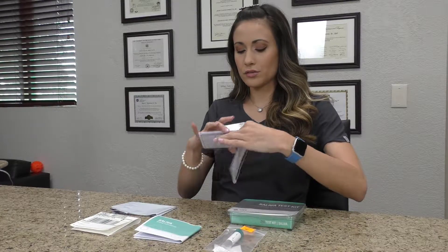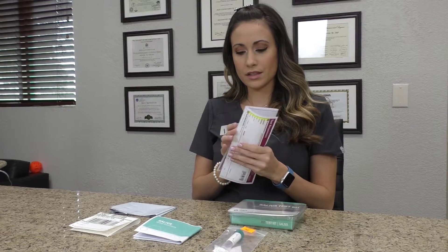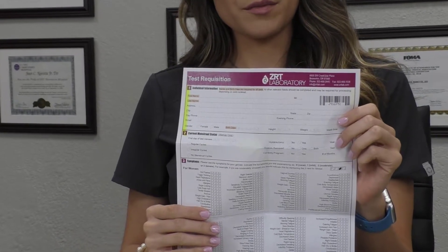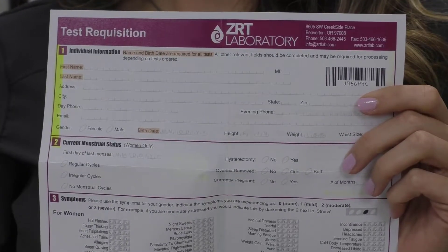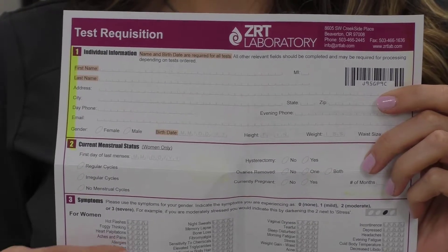We will go through the requisition form first. We highlight the areas that need to be filled out. You can see up here on top is where you put your personal information — name, address, things like that. Don't worry about all the other sections that are not highlighted.